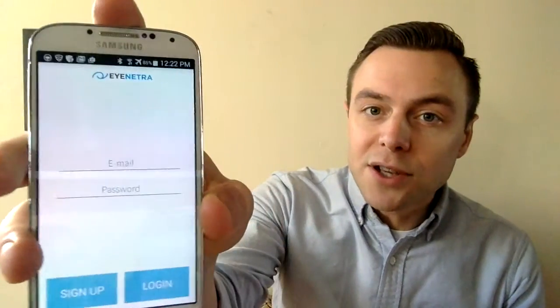The first time you open up your EyeNetra application, you will see a screen asking you to sign up for an EyeNetra account. You can do this quickly and simply by providing any valid email address, creating a password of your choosing, and clicking Sign Up. Please note that during this initial sign-up process, you will need to be connected to Wi-Fi; however, Wi-Fi is not required to use the application to screen your patients.